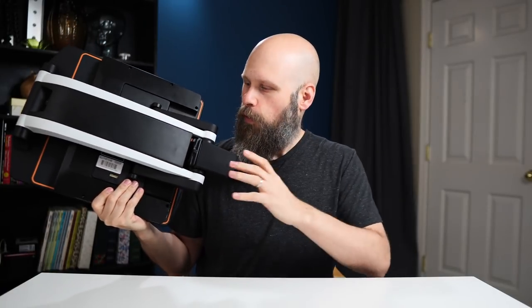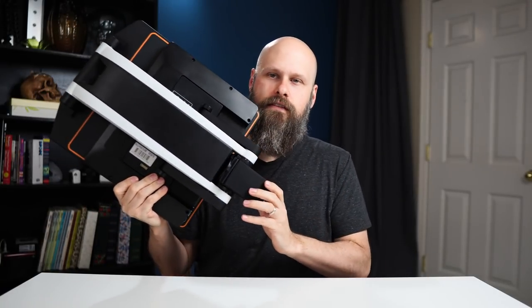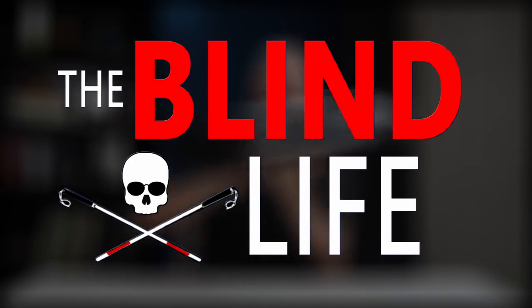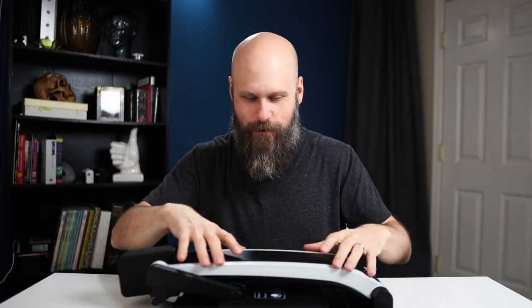Today we're taking a look at a new portable foldable CCTV. Hey guys, it's Sam with the Blind Life. So today we're gonna be taking a look at the new MagnaLink Zip. This is brought to us by LVI, Low Vision International, and my buddy Charlie let me use this to make this video.